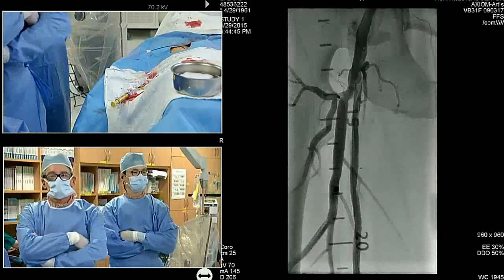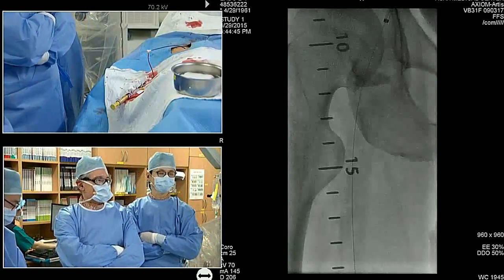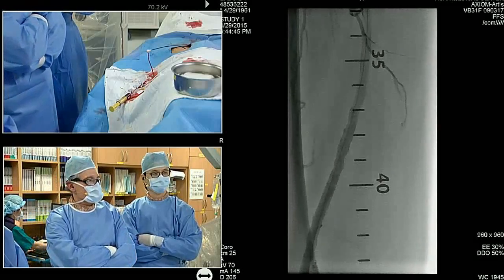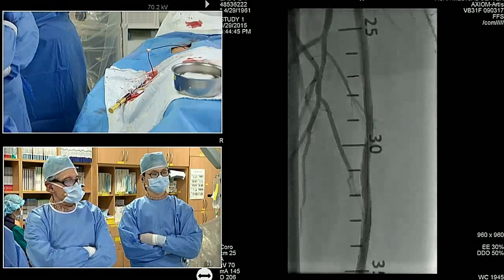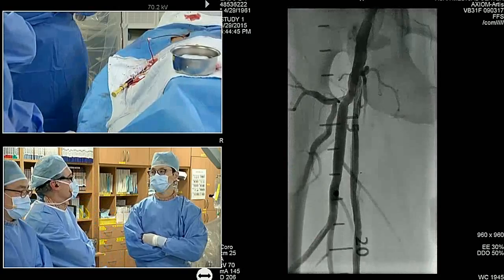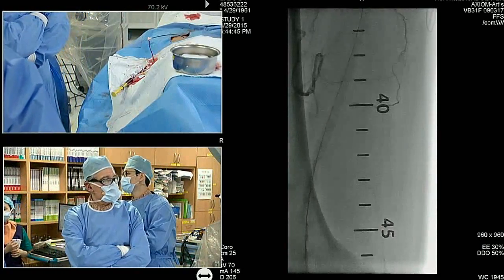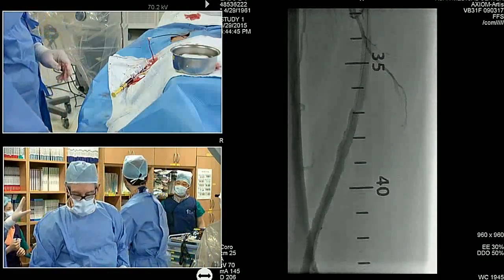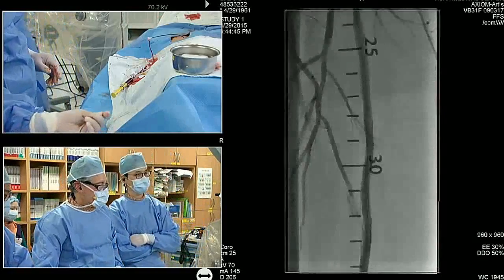Well, I think we're done. No. So this, being the origin, is clearly a good case needing DCB and so-called spot stenting, maybe only proximal? I would agree. Yeah. I think that changes the game, huh? Do we have 6 millimeter DCBs? Or do you want to make another oblique of the SFA, maybe from another angle that looks more severe disease? Or is this dissected? Yeah, sure, certainly.